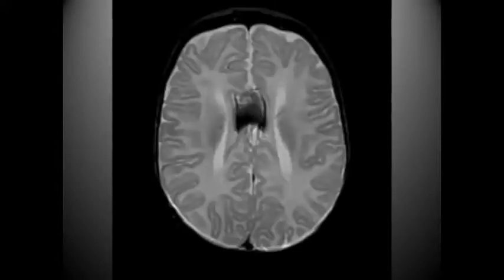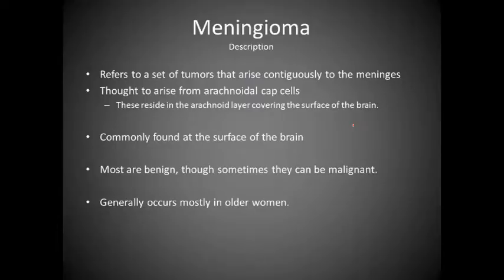Okay, here's another example of a lipoma. Notice that we're in the longitudinal fissure once again, and we see this mass-like structure, different from the brain inside, and that is a lipoma. It won't cause any abnormalities inside the patient at all.